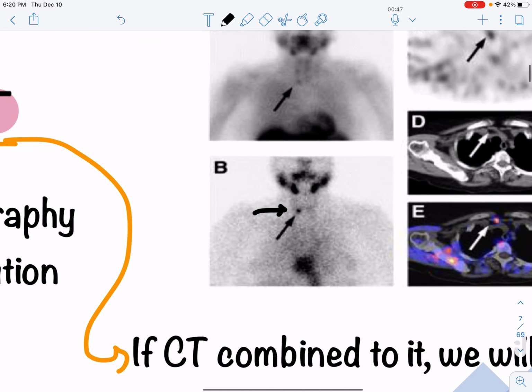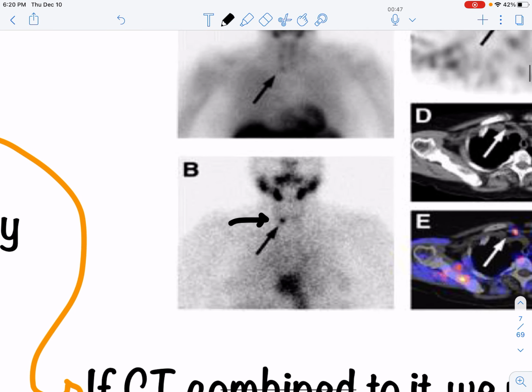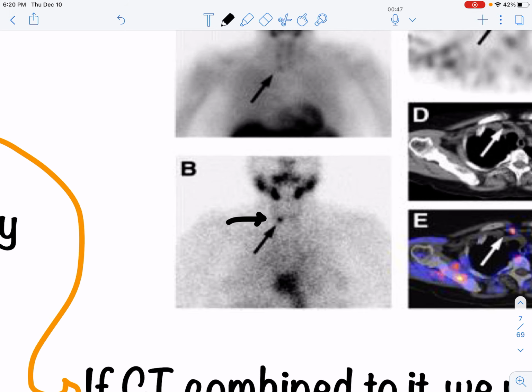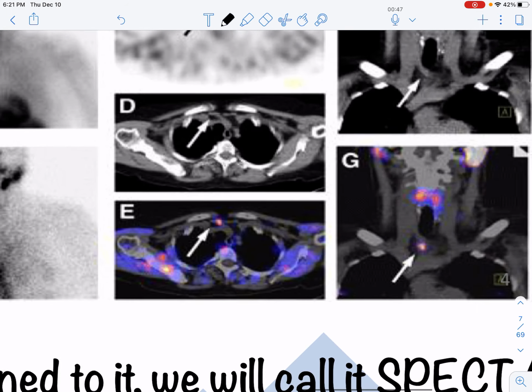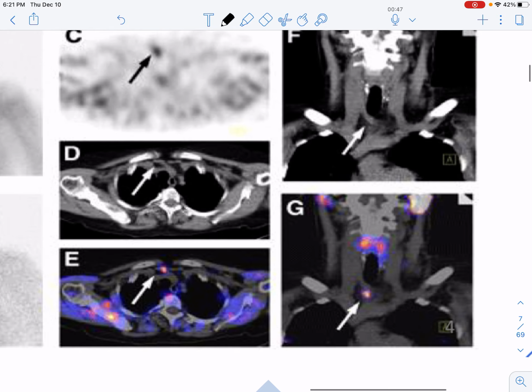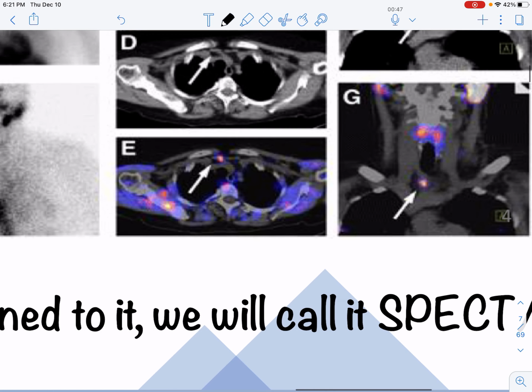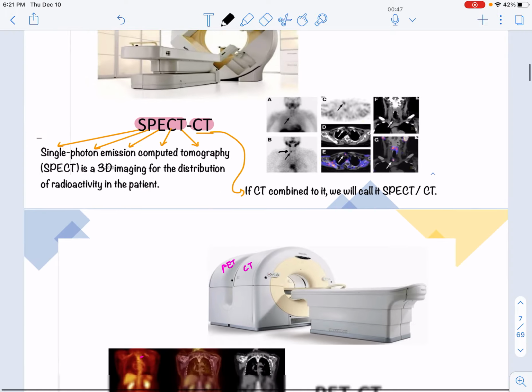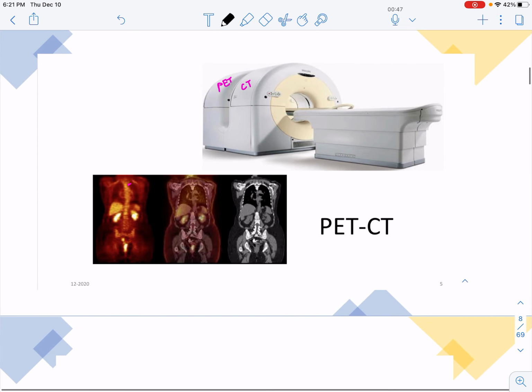If you can see, من هذه الصورة نقدر نعرف فين exactly this lesion، بس لما نحط modality تانية، modality تقدر تورينا anatomical part so we can exactly detect where is the lesion. So عشان كده مرة مهمة SPECT CT. PET اختصار ل Positron Emission Tomography، Positron Emission Tomography and CT part.